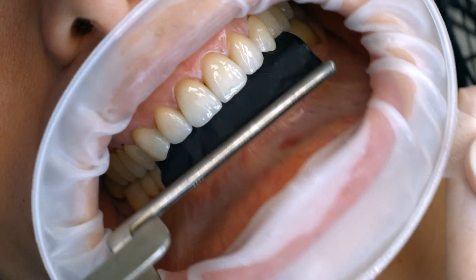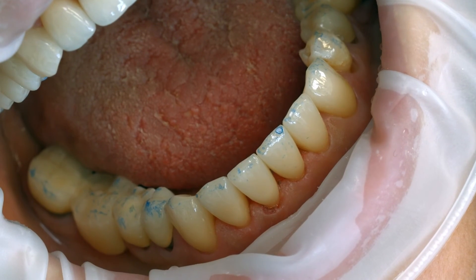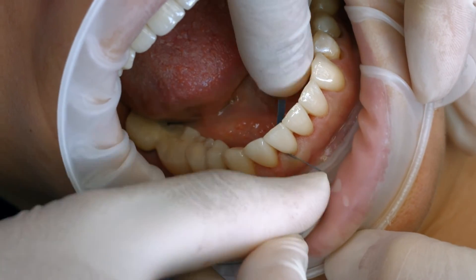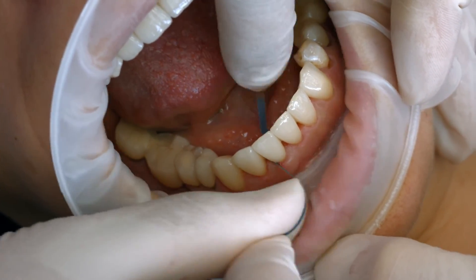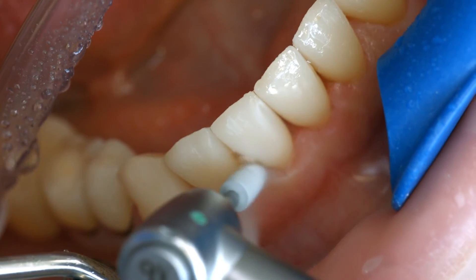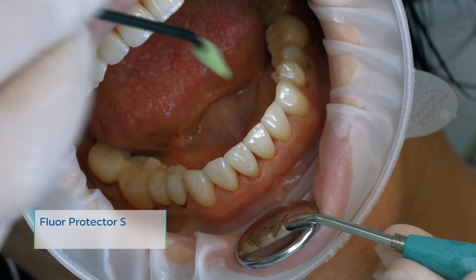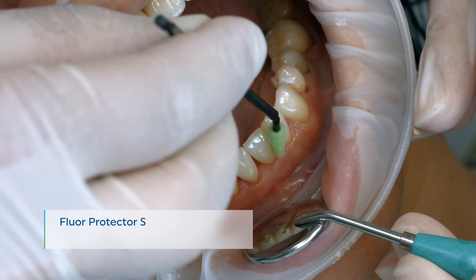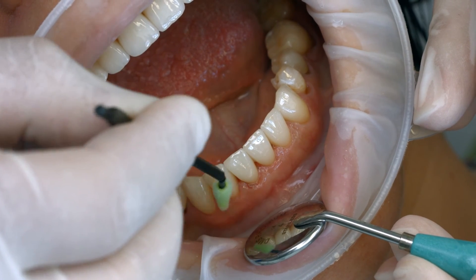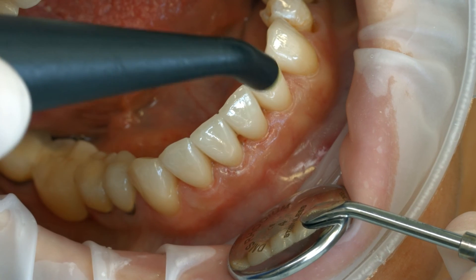Check the occlusion and functional movements and make adjustments if necessary. Finish the proximal surfaces using finishing and polishing strips. Polish the restoration margins with polishers such as Astropol, or with discs. As a final step, apply a thin layer of Fluor Protector S using a Viva brush or a conventional brush, then use the air syringe to disperse and dry the varnish.